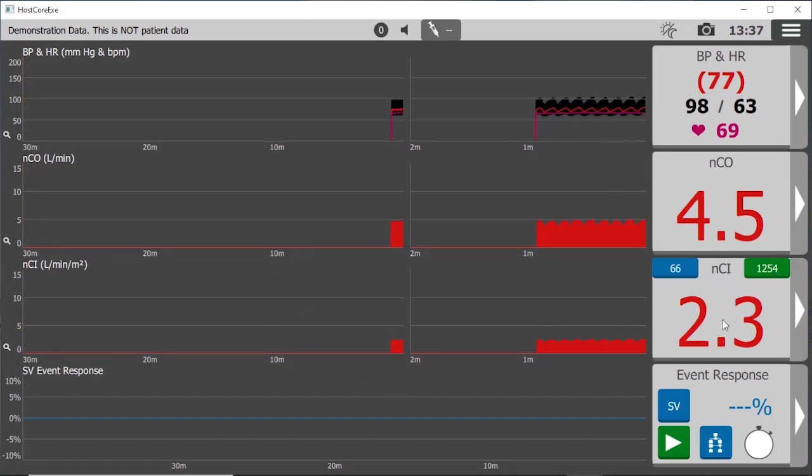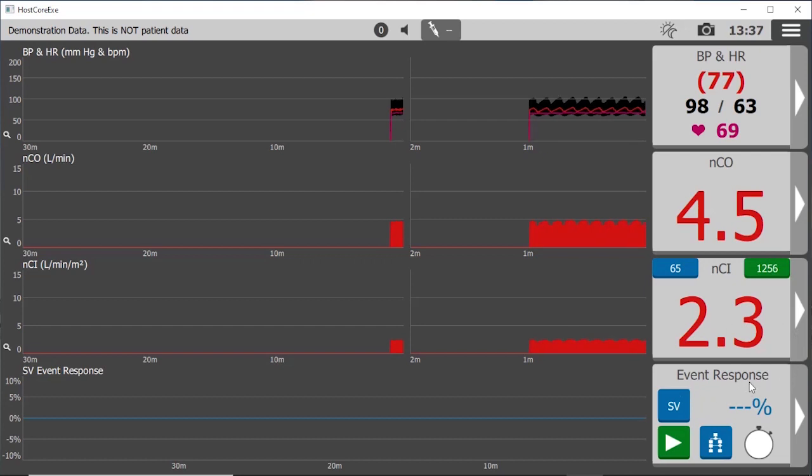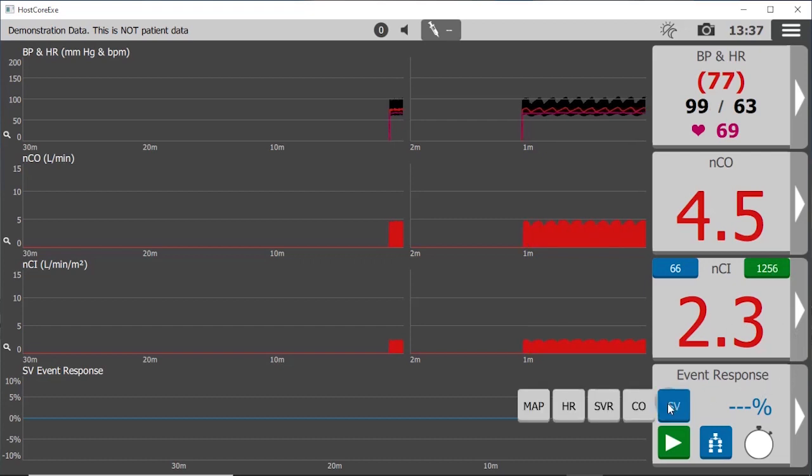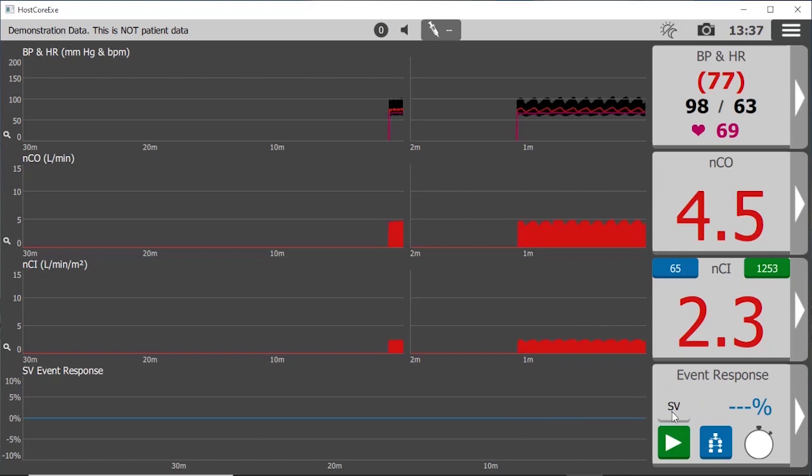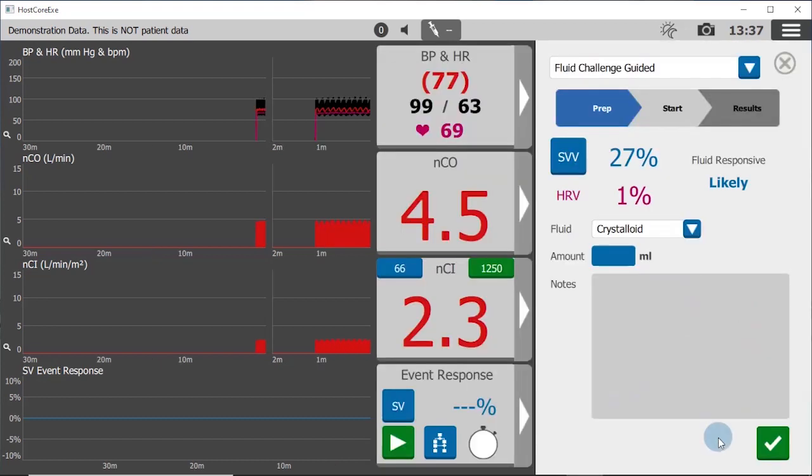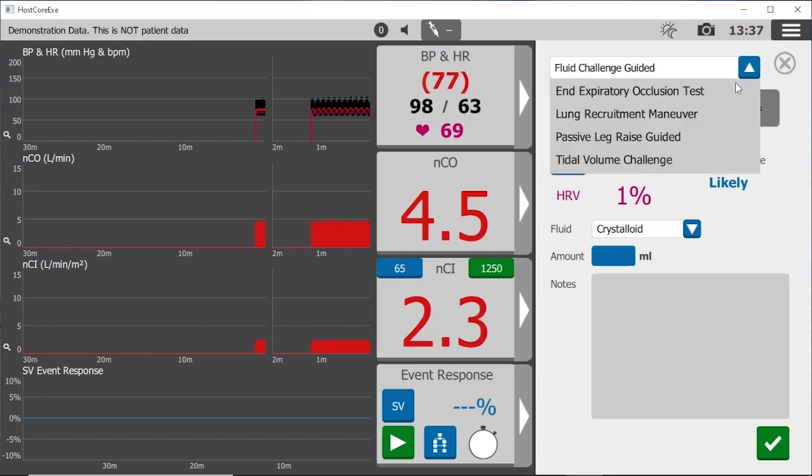And finally, with event response, we can quantify changes in stroke volume or any one of the measured parameters. It provides guidance for interpretation of dynamic response tests like fluid challenge or passive leg raise and tidal volume challenge.